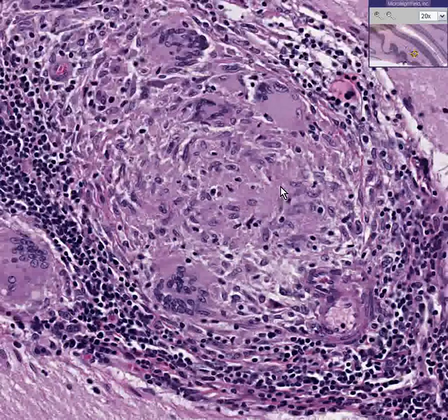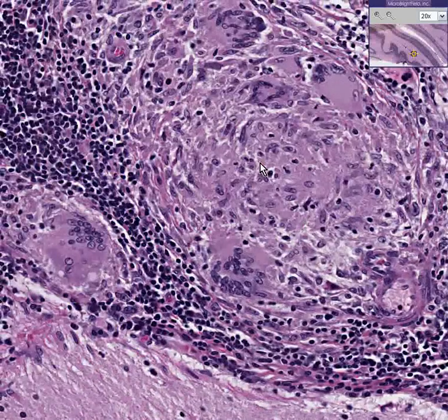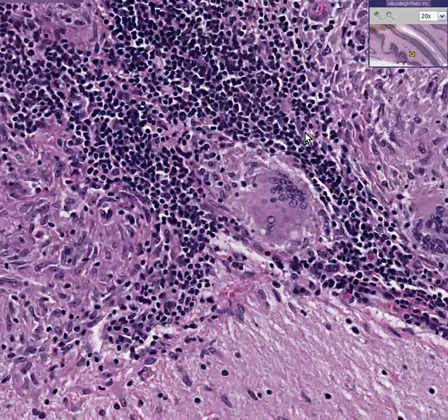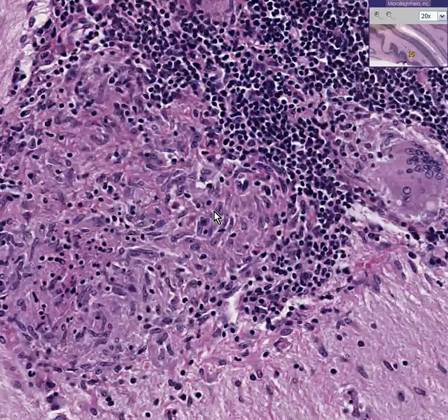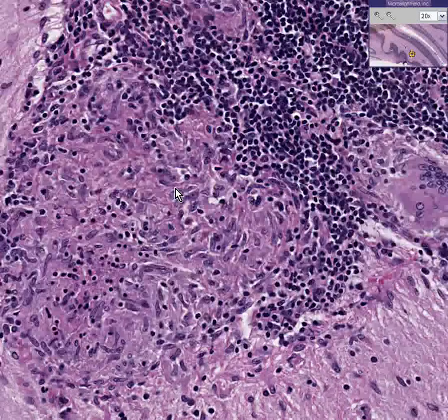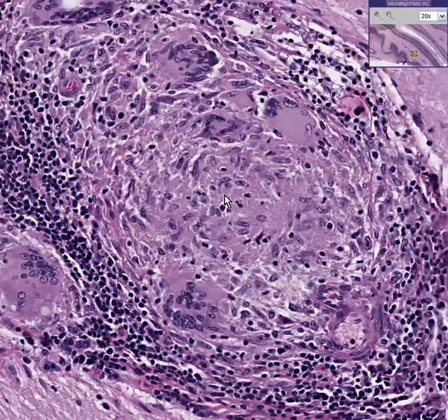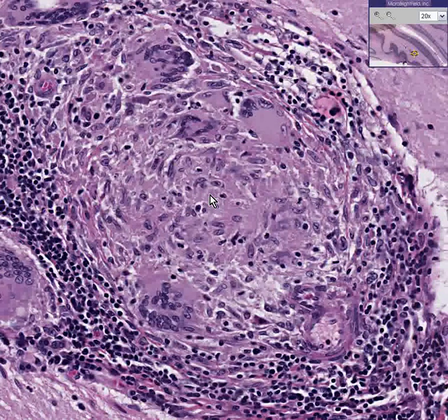In all honesty, the correct diagnosis for this case would be non-caseating granulomas of cerebellum. Well, that could be literally due to anything. Could it be TB? Could it be fungal diseases? Could it be foreign bodies? Could it be certain viruses? Of course it could be.